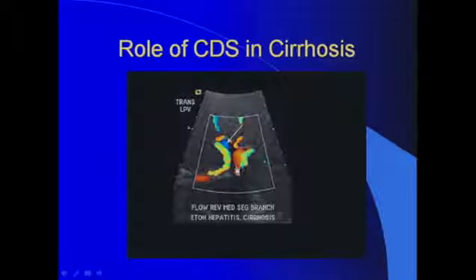Now, as I said earlier, we need to pay attention to these big hepatic arteries. The hepatic artery in this instance, the left, and its branches into the left lobe show evidence of significant color aliasing, which indicates enlargement and suggests increased arterial flow to compensate for the diminished portal venous flow going into the liver.